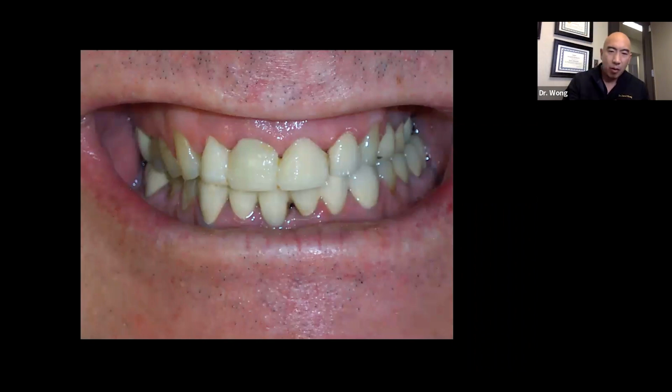And when we do that, what you're going to see here is by that time that's fully seated, by the time he comes back in 2 weeks, I didn't make that temporary bridge, by the way. By the time he comes back in 2 weeks, you'll see how that tissue is molding perfectly around that pontic area. And the tissue is nice and healthy. And we've got preservation of the ridge dimensions, which is the intent of socket grafting.